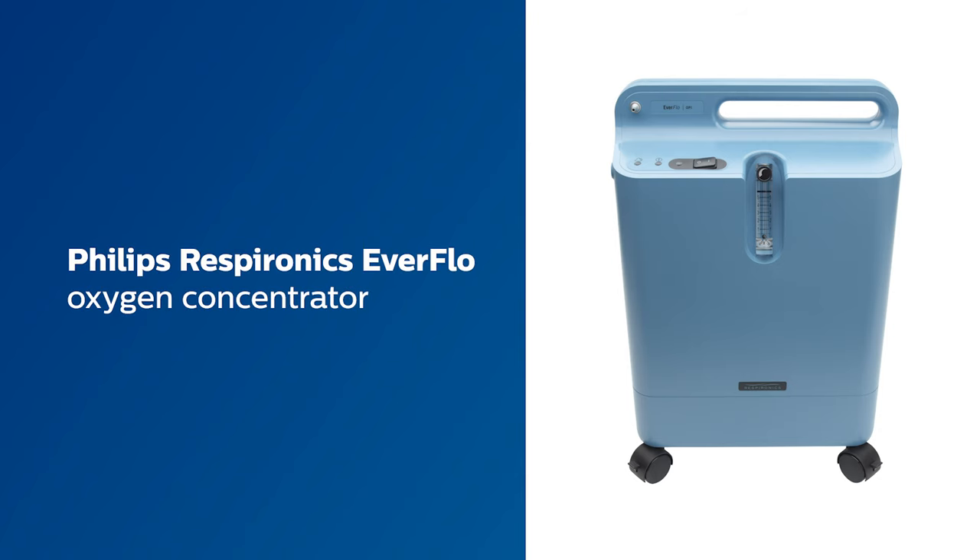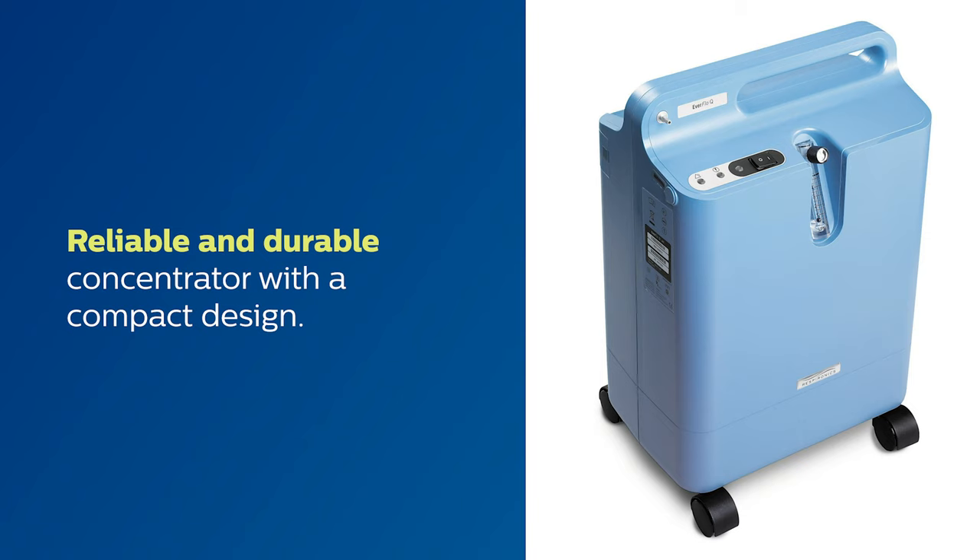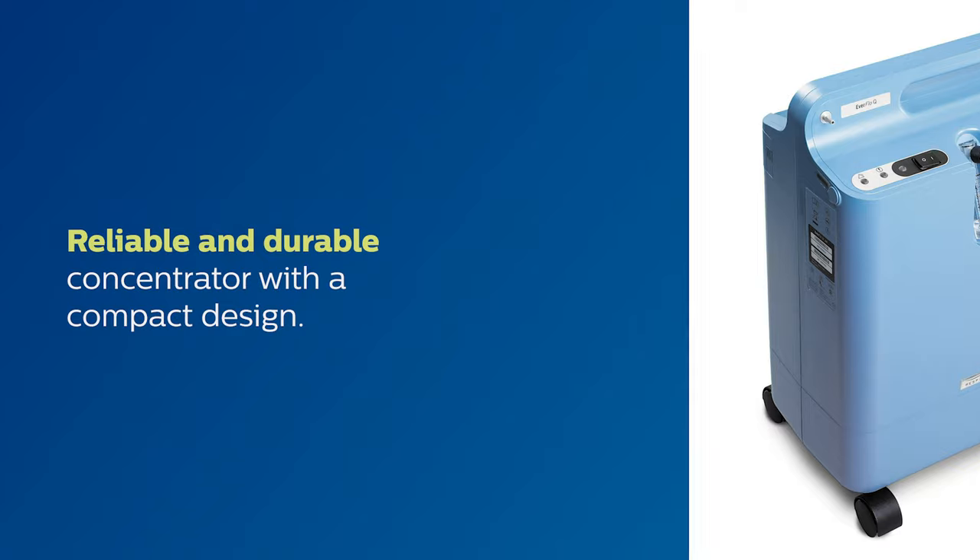This is an introduction to your Philips Respironics Everflow Oxygen Concentrator. The Everflow Concentrator is a reliable and durable concentrator with a compact design that will stay out of your way. In this video, we'll walk you through how to get started with your concentrator and introduce you to some of its most important features.